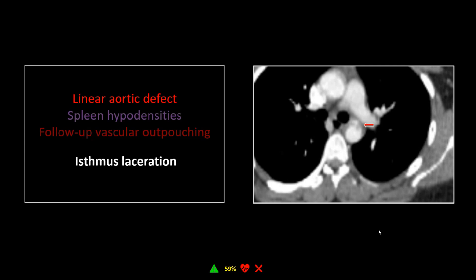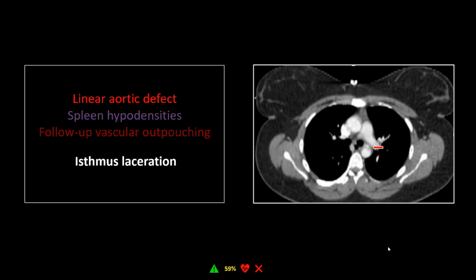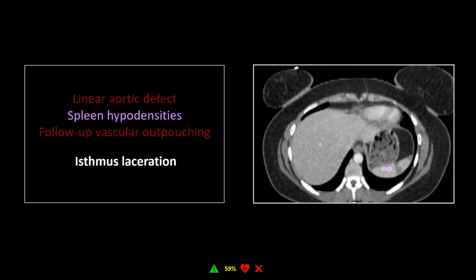It's also where the ductus diverticulum can live — a normal, broad-based outpouching at the isthmus region of the aorta. But this is far too irregular. There is a very slight density around this aorta — you always want to look for a little density in the periaortic mediastinal tissues. There is a tiny crescent of gray, but it's almost nothing compared to most aortic lacerations. So I was really given a moment: that is too irregular to be a ductus — it's got to be a laceration. But there's so little stranding, I was doubting myself. Then I went down into the abdomen and found well-demarcated, subcapsular, wedge-shaped hypodensities in the spleen.